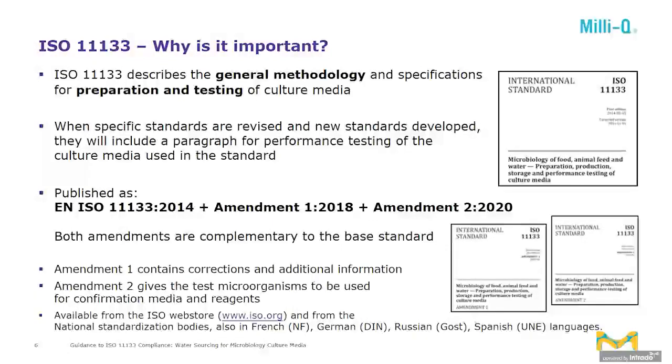The ISO 11133 describes the general methodology and specifications for preparation and testing of culture media in the area of food, animal feed, and water microbiology. When specific standards are now revised or new standards are developed, they will include a paragraph for performance testing of the culture media used in this standard. But the general methodology, how to prepare a medium, how to test a culture medium for microbiology, is still described in ISO 11133.